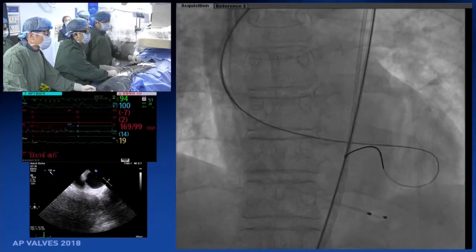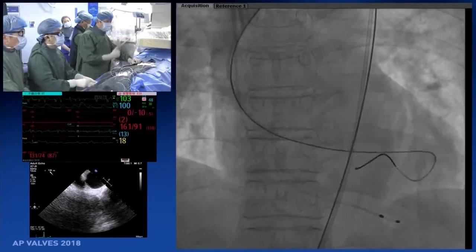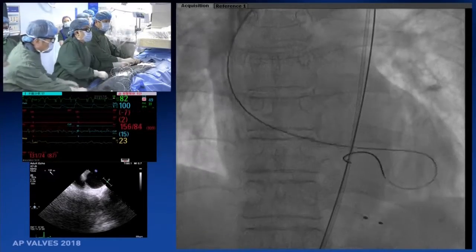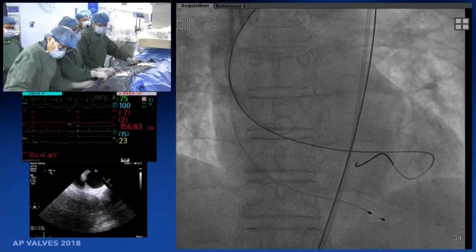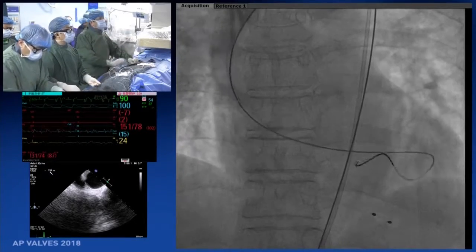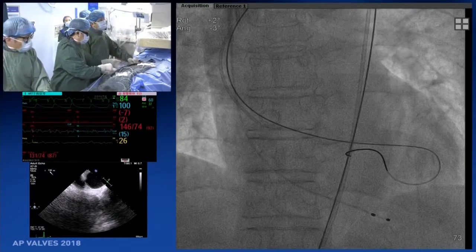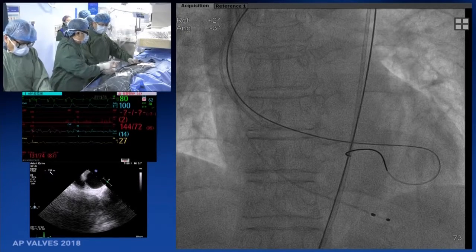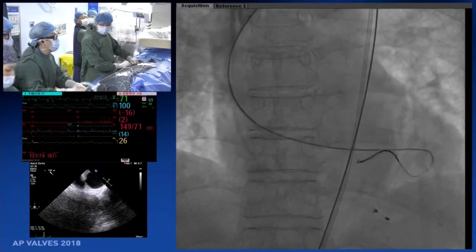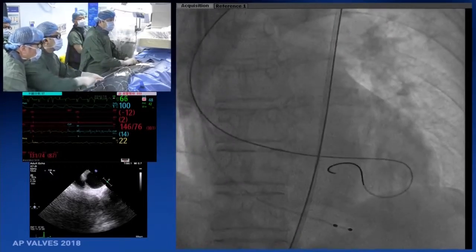I think if we could choose whatever. But we have to hold the wire tightly. Otherwise, because of the pump effect, it may cause the wire to pump up. So now we are going to do, however, there are too many ventricular ectopies. I'm a little bit worried about the tension of the wire attached to the left ventricle wall. So would you hold the wire, please? Don't move the bed, please. Just a minute.